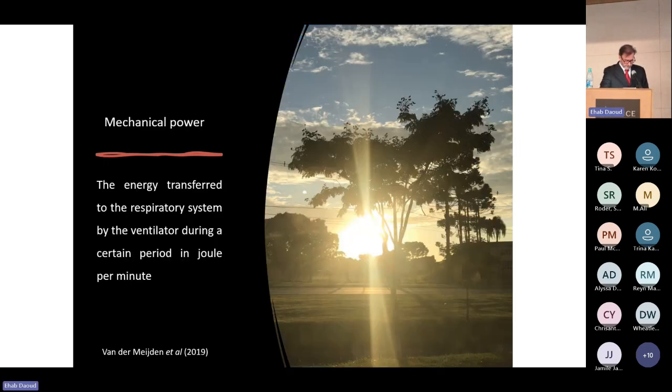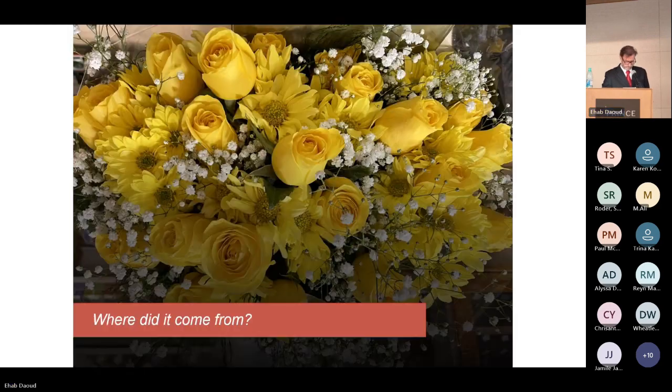By the way, the unification will allow us to obtain the mechanical power, which is the energy transferred to the respiratory system by the ventilator during a certain period, in joules per minute. But where did it come from? It came from physics.